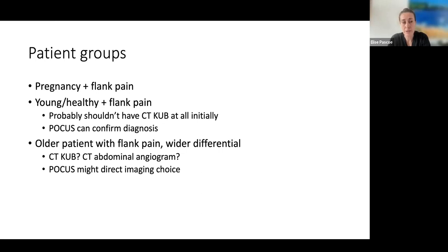So using a bedside ultrasound might give you the opportunity to confirm your suspicions if there's unilateral hydronephrosis, and have a discussion with the patient about that diagnosis, their expectations, and reasons that they might need to come back for more formal imaging or for CT imaging.